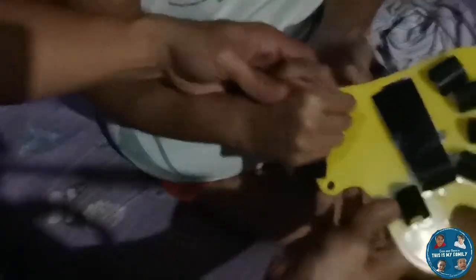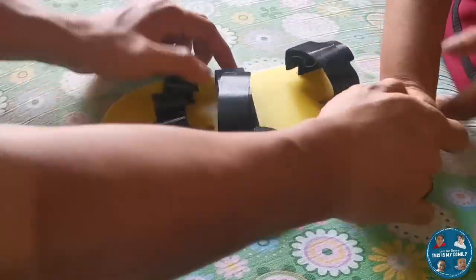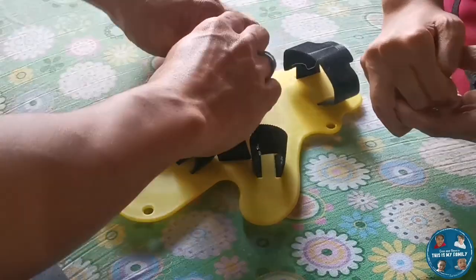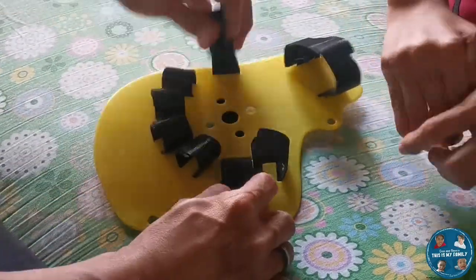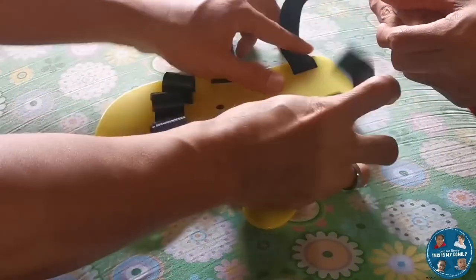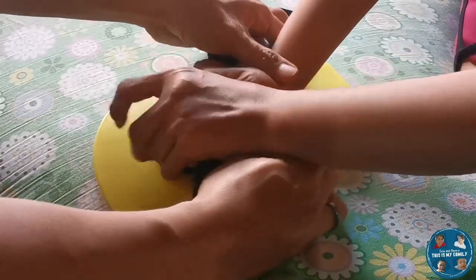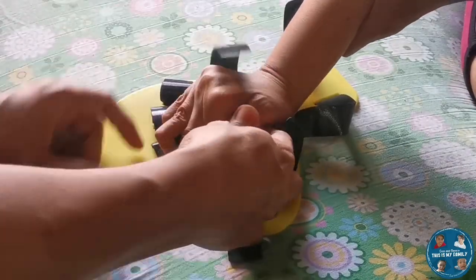Such conditions include Parkinson's or peripheral neuropathy. The features of this item are that it controls the increase of muscle tension and prevents muscle atrophy. It also prevents finger flexion, convulsion, deformation, and deformity.